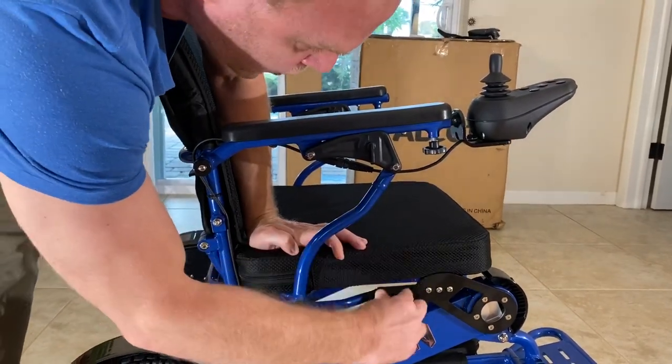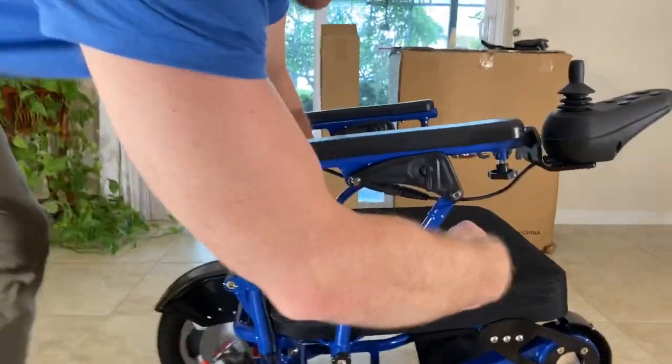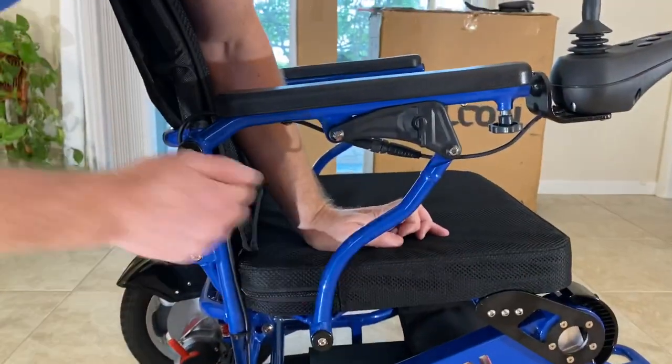We don't have a bar that's straight down attached to the frame that would keep your legs locked into the chair. This allows proper ergonomics.